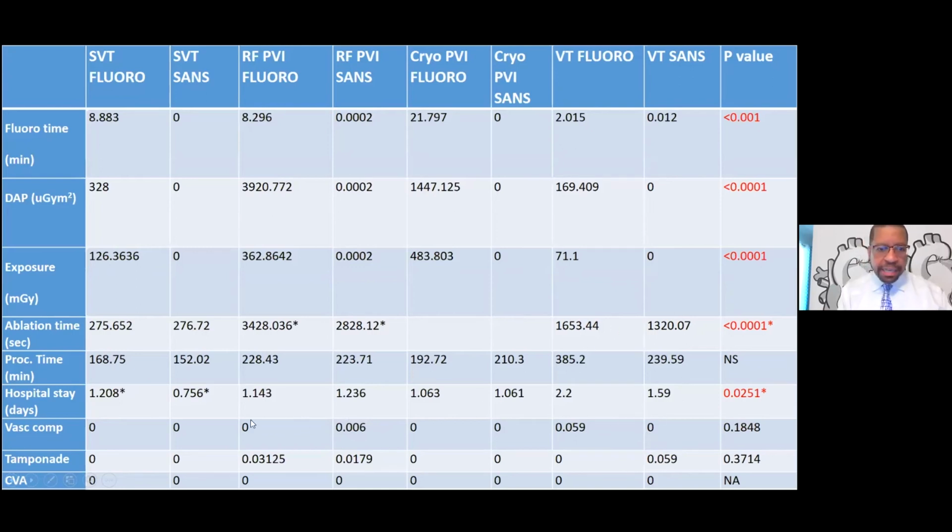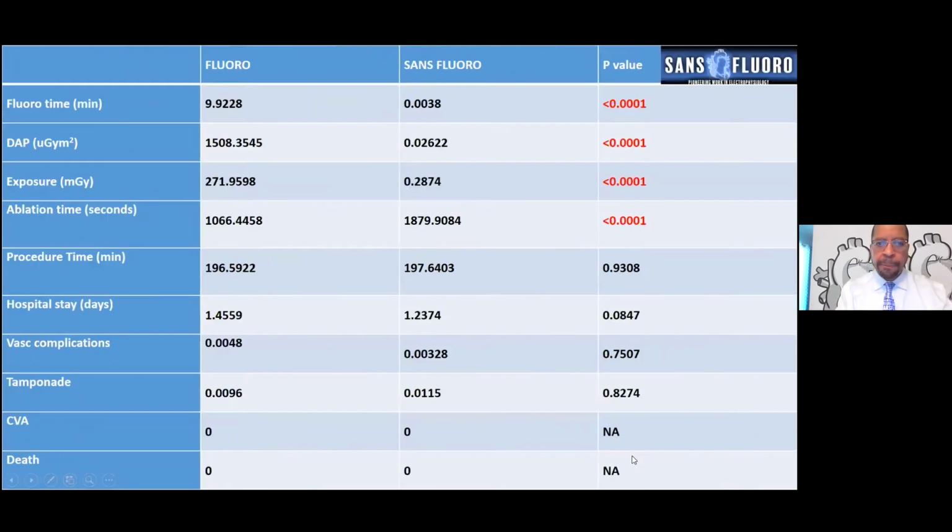okay? And when you look at vascular complications, they were really small. And in this case, maybe 3 patients overall got CTs prior. So that again points to why ICE is so important. There was one patient that I could not find a left superior pulmonary vein on. So I got a CT on him afterward, and it turned out, she was a woman, she had lung cancer. And when I went back to the reports, it was actually tied off. So if you have good ICE techniques, I never do routine CTs, only if it's a third or third redo. We had no strokes, there were no deaths, and the amount of serious cardiac complications were really low, less than 1% in each group. Now, just skipping forward to get to the meat of the matter.